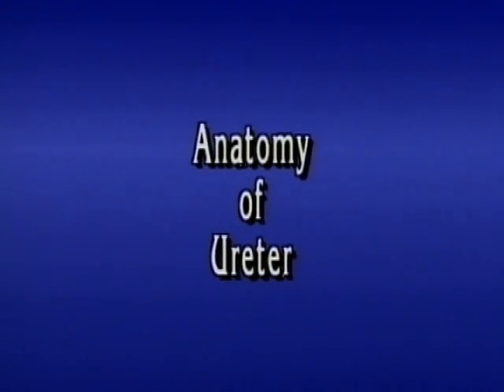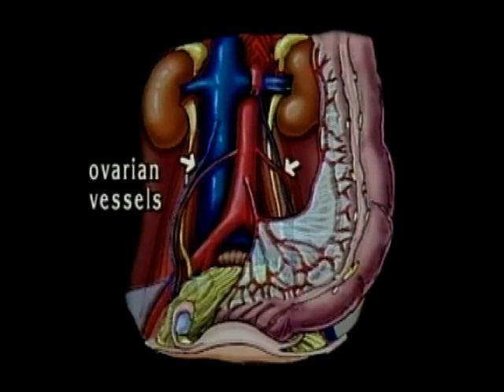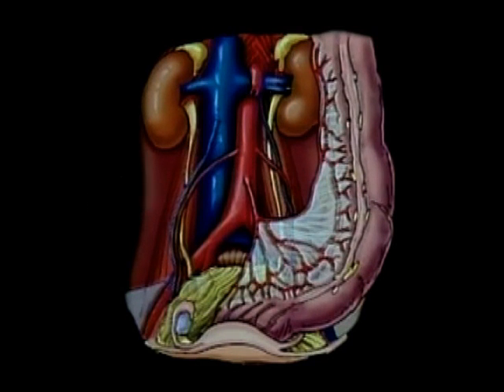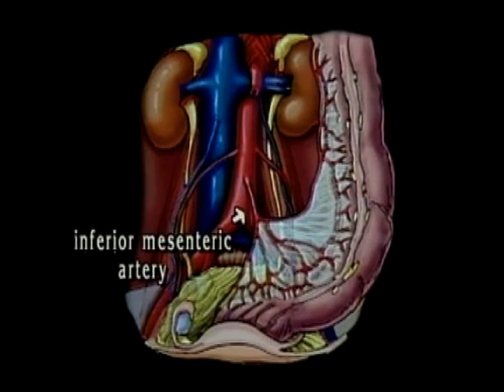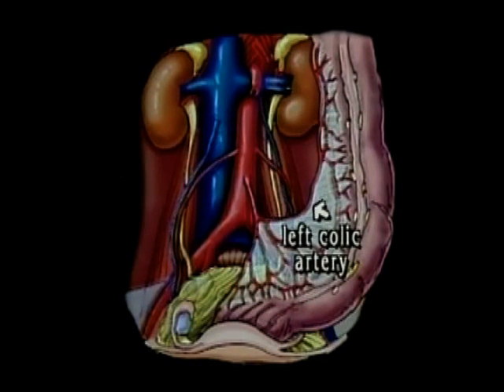The ureter is equally divided into abdominal and pelvic segments. In the abdomen, they run medial to the ovarian vessels. The left ureter is crossed anteriorly by the inferior mesenteric artery, the left colic artery, and the sigmoid colon.